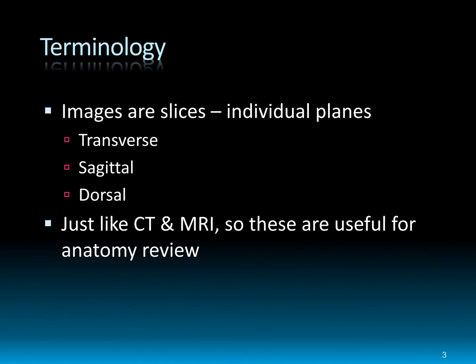So, anatomy. Remembering how we obtain sonographic images. Each of those images represents a slice, and it's barely three-dimensional. It's almost a two-dimensional slice. So each slice is an individual plane. Nomenclature is pretty much as we've learned from before in anatomy.